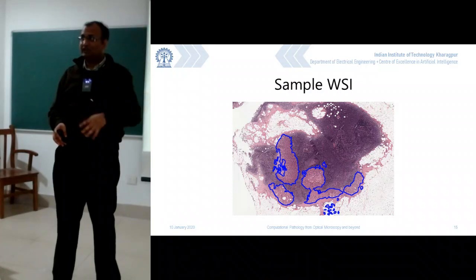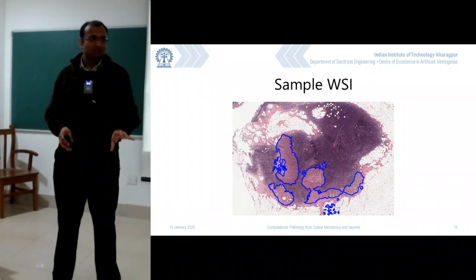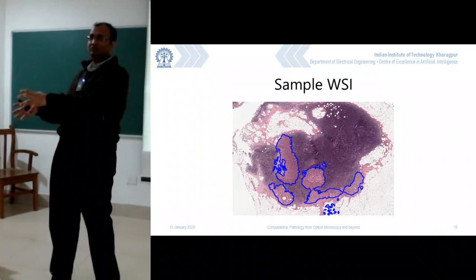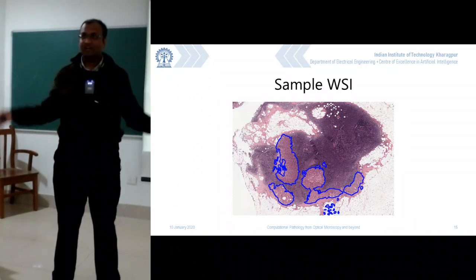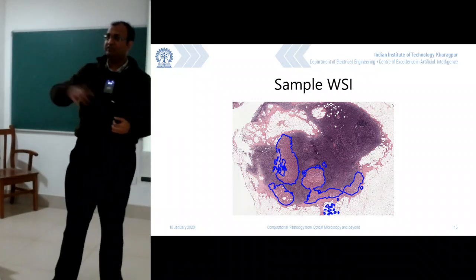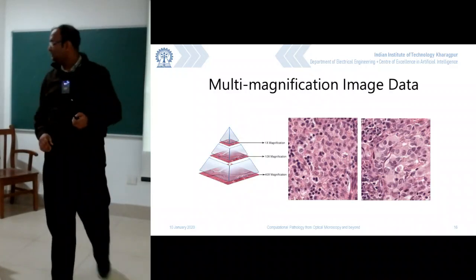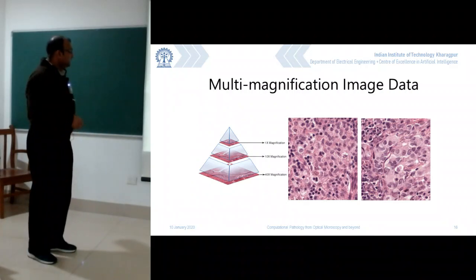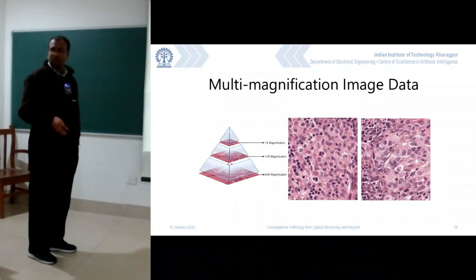And this is where all of machine learning comes into play, where we essentially try to derive this knowledge of what low resolution manifests into what set of high resolution. Given that you have ample data surrounding this, you will be able to derive these 1:1 transformations. So this is about understanding how things would change from one level to the other.